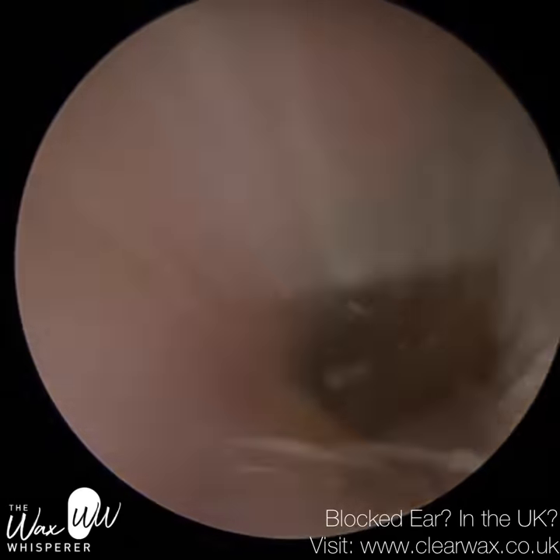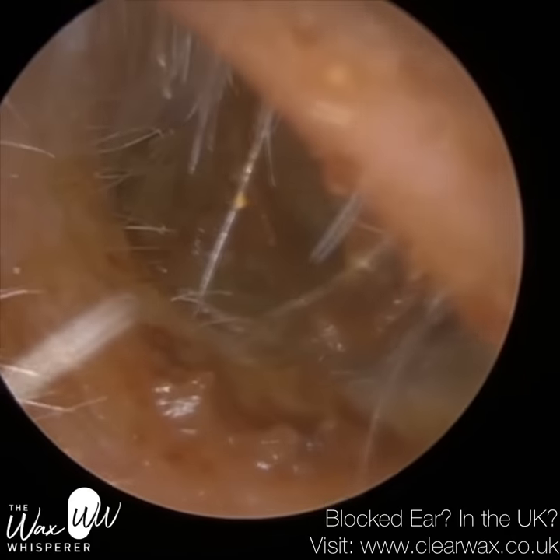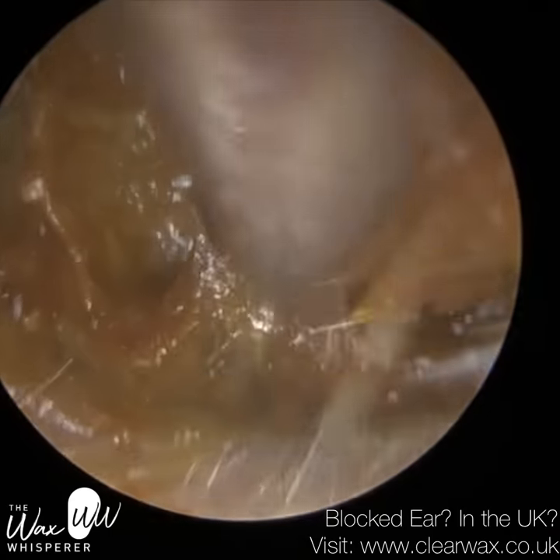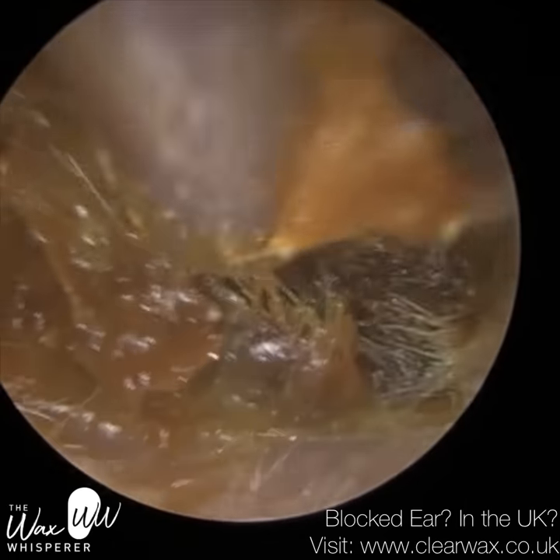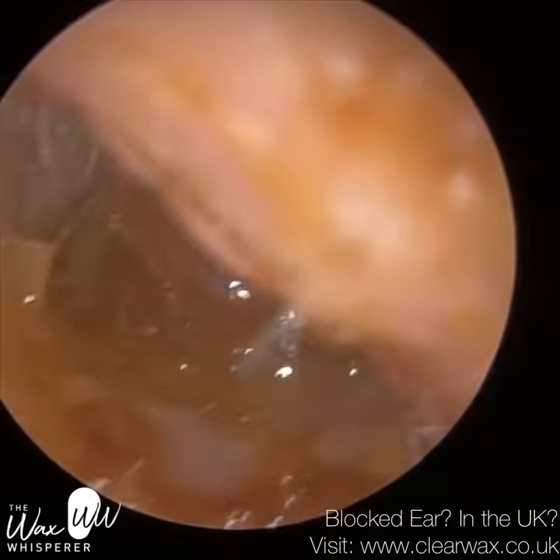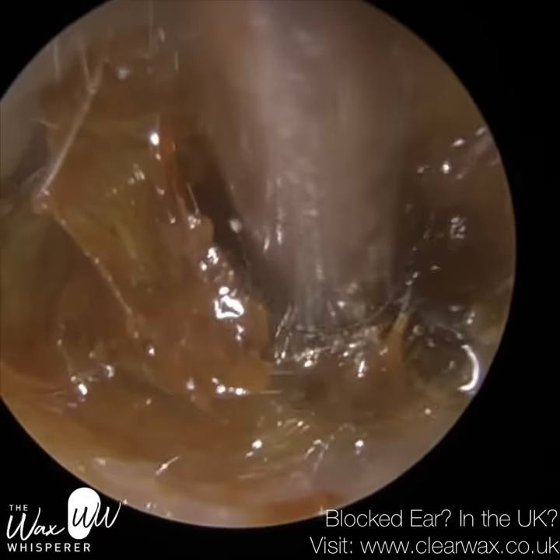We have here a patient who attended with bilateral fully occluding earwax, as you can see. And we're just commencing with their left ear first, which the patient felt was the worst out of the two. This wax plug extends all the way from the entrance to their eardrum. There is some evidence of cotton swab misuse. You can see the indentation at the surface, but the patient advised that they didn't use anything in their ears.